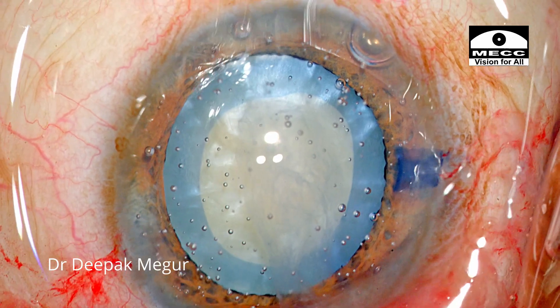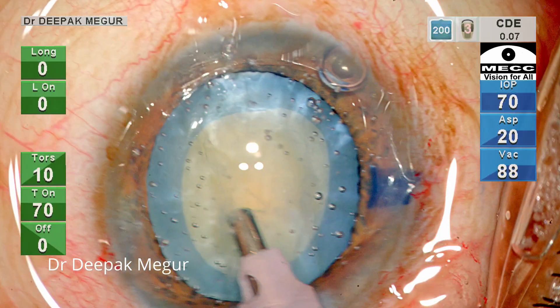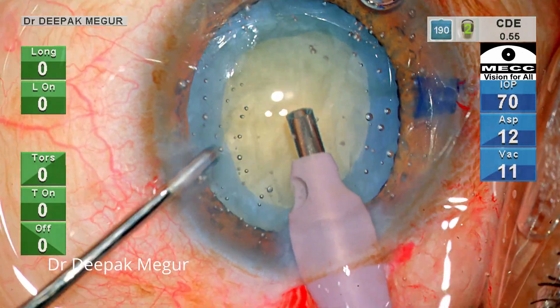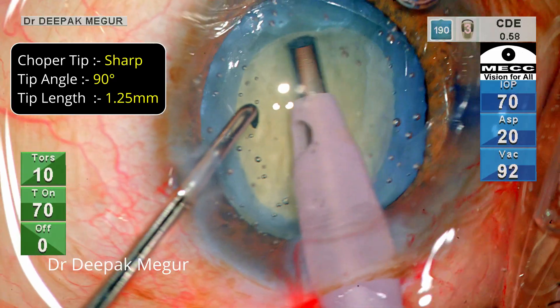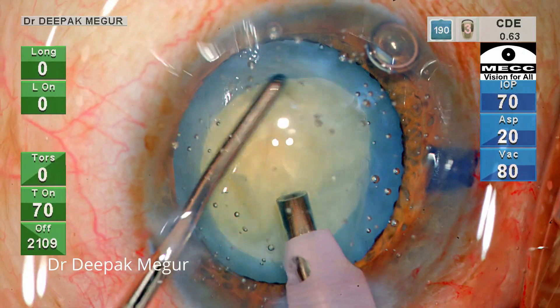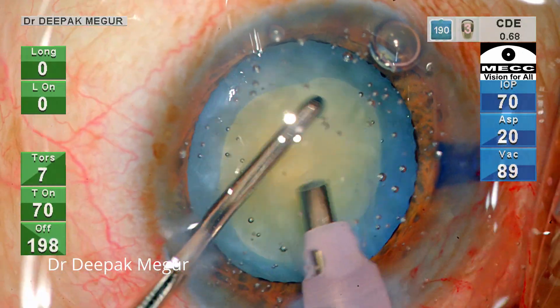Let's see what precautions we take when trying to deal with these chopping manoeuvres. The epinucleus and the cortex are aspirated initially. I am using a chopper which has a sharp tip and an inside cutting edge — it's a Rexroth chopper, at 90 degrees, with a tip length of 1.25 mm. The cataract doesn't look to be dense; it looks soft, so I shouldn't have much of an issue here.